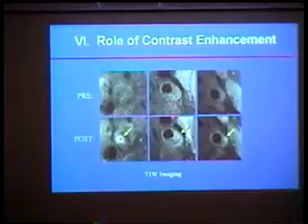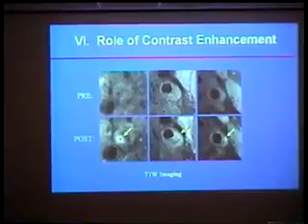So by comparing this image and this image, you can get a fairly extensive picture of what the lesion tissue is. The third one is a relatively early lesion, and you see a pocket of enhancement shown in this arrow region. There's also this little band that is completely non-enhancing. So this contrast enhancement clearly helps. One is improved tissue contrast. Two is that this type of imaging may tell you something about the activity levels within the lesion, as reflected by the distribution of microvessels.